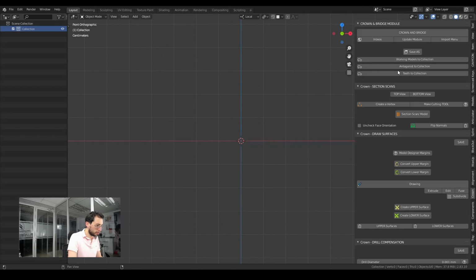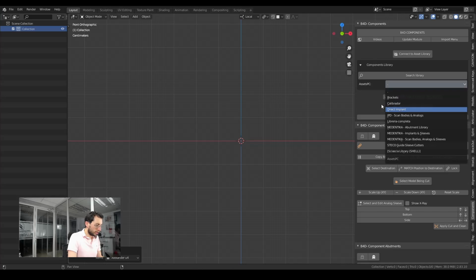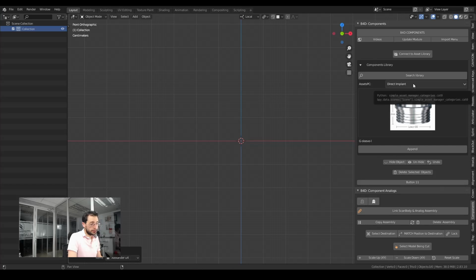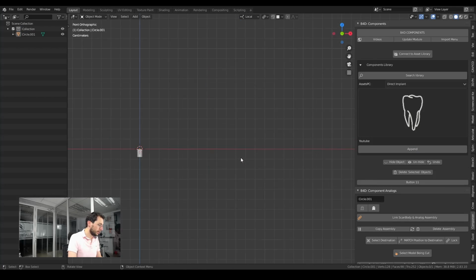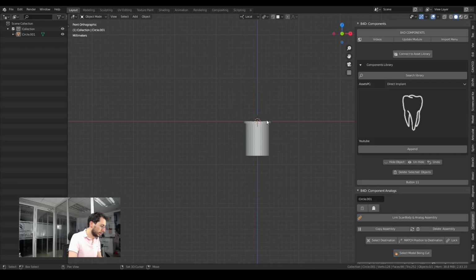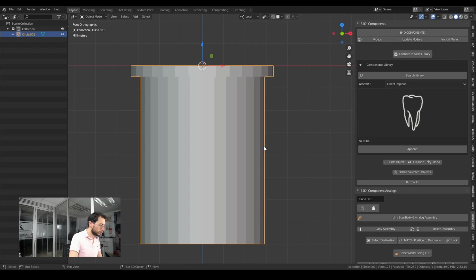here to my components module, which is this one. I can go exactly to my direct implant folder, and here I have the previous cylinders I already designed and my YouTube cylinder. When I click append, it will show in the middle of the scene with the correct dimensions, correct shape, correct position, everything is correct, and that's easy, it's that simple.